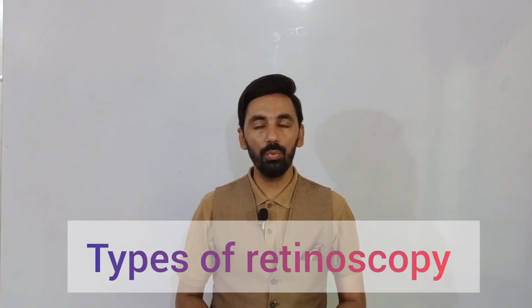So this is the most important indication of dynamic retinoscopy. If you find that the patient has either a lag of accommodation or a lead of accommodation, then you will perform the process called dynamic retinoscopy. And now let's start the different types of dynamic retinoscopy.